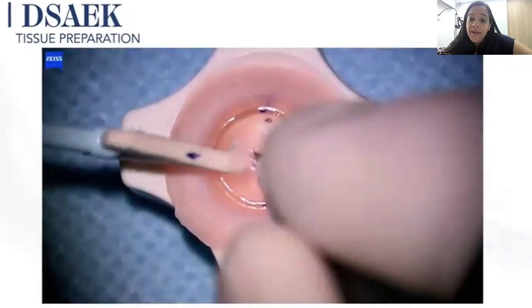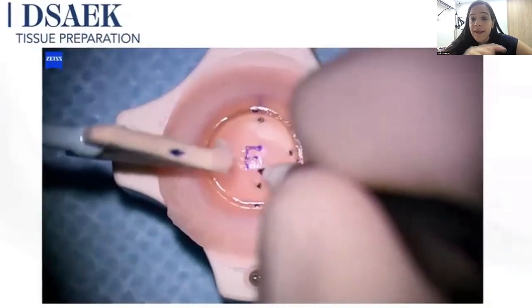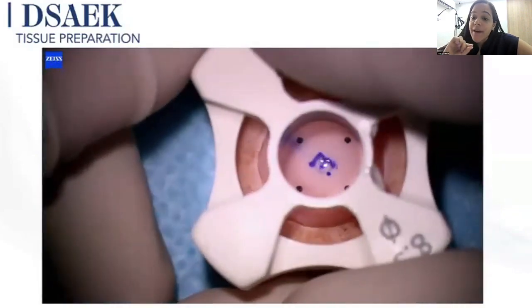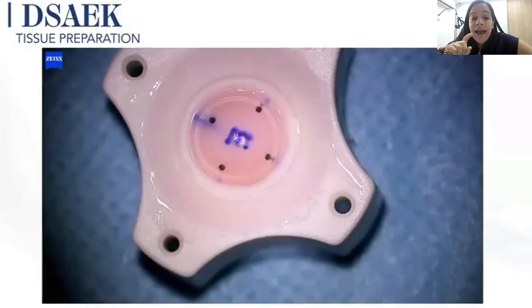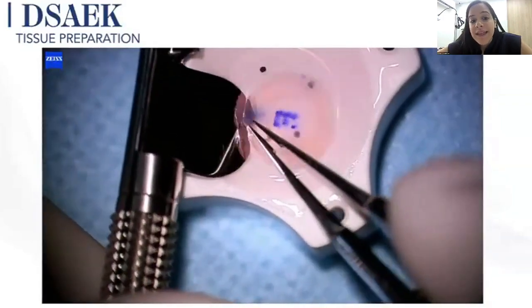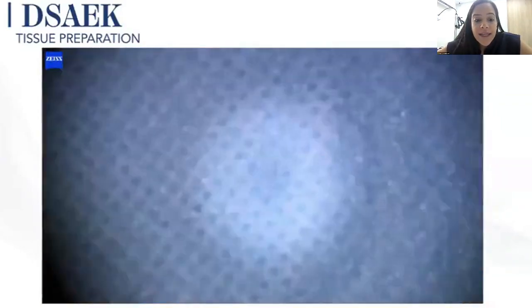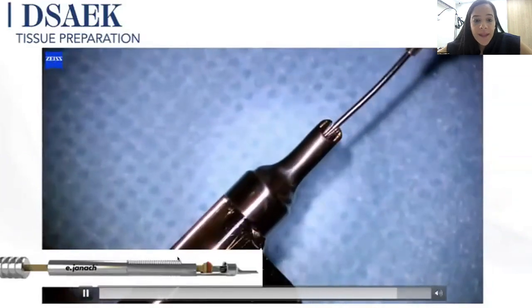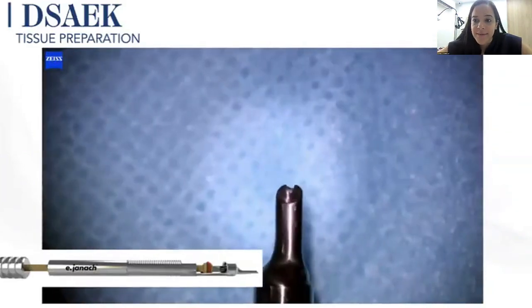So you will receive your corneal scleral rim with the bed already done. Some surgeons mark the graft to help with orientation, and afterwards, after trephination, we load the graft into the inserter. Here, I'm using the one called the Macaluso inserter, and I'm using the MSD forceps.